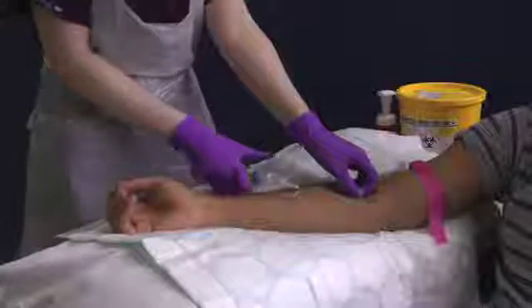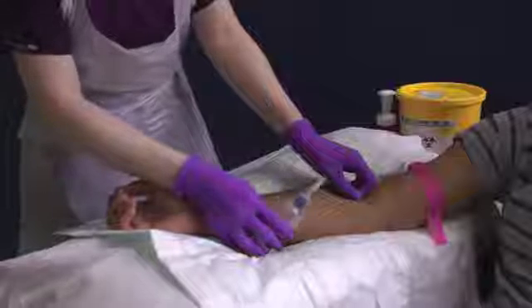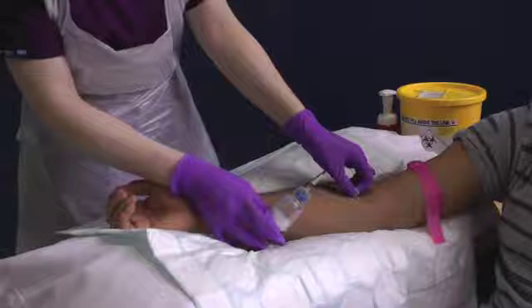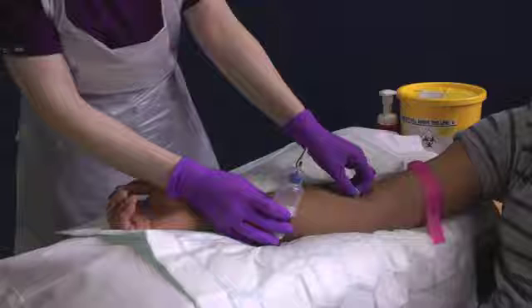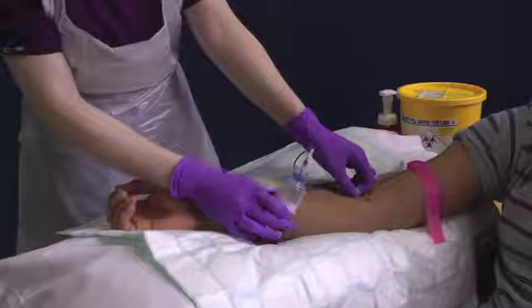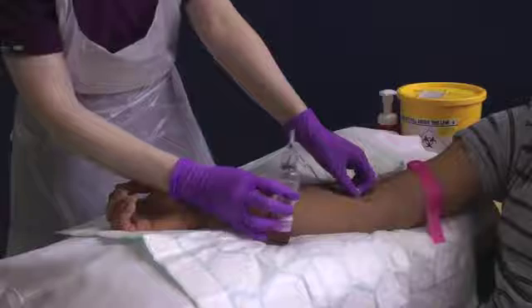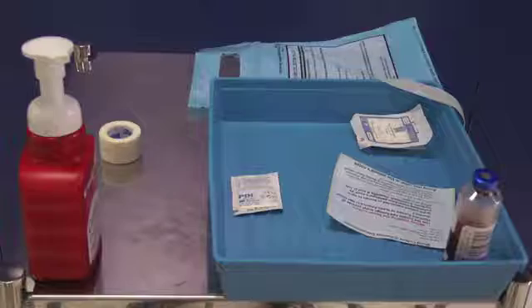Whilst immobilizing the needle with one hand, take the aerobic blood culture bottle and pierce the septum using the adapter cap. It is important to fill the aerobic bottle first, as there will be air within the collection set. Hold the bottle upright and collect 10 milliliters of blood. Remove the aerobic bottle and repeat the procedure with the anaerobic bottle. Remove the anaerobic bottle and release the tourniquet.